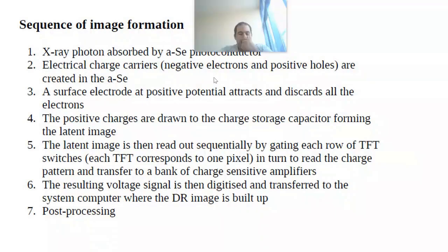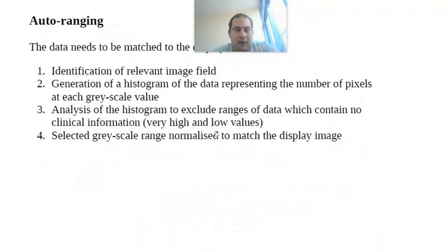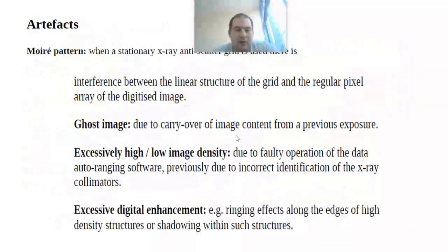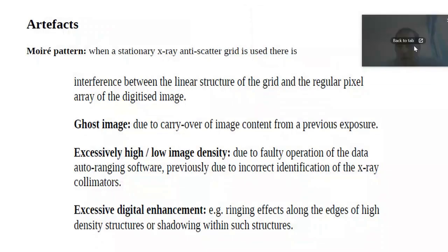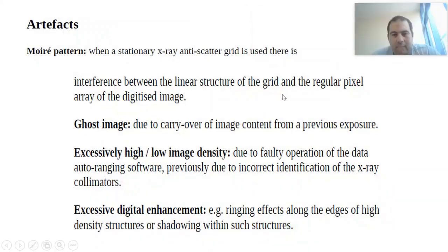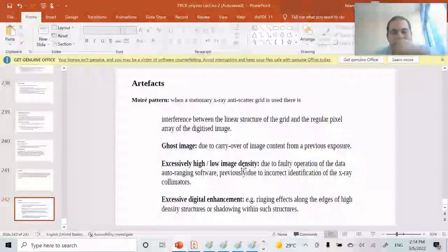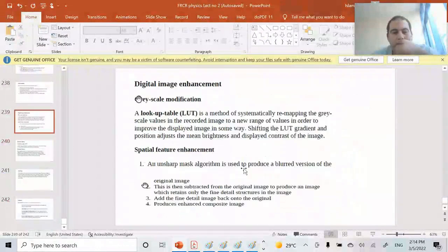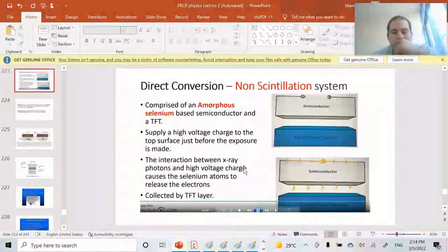Film radiography, whether it is from film radiography to digital radiography. So we are now at the part that remains in this section, which is the part that talks about artifacts. I wanted it to be the last thing, because there will be some related topics like dead pixel artifacts and post-image processing and things like that. I would like to include some images in the topic to make it clearer, God willing.